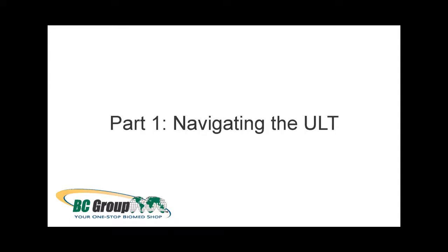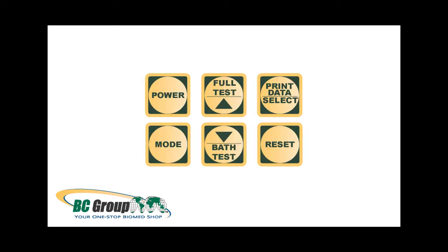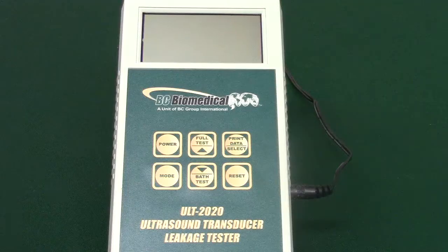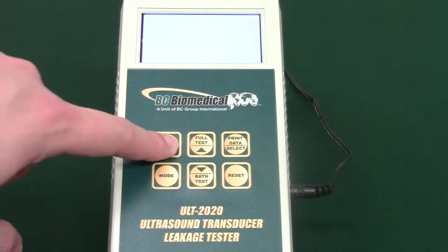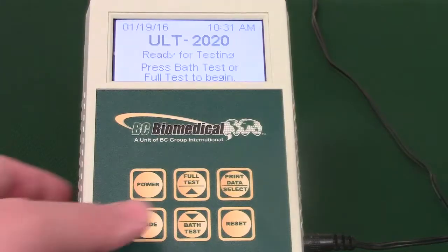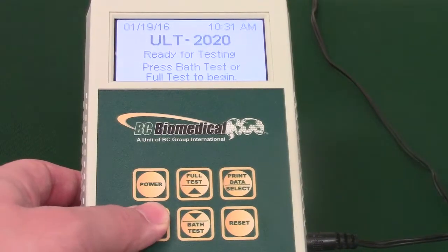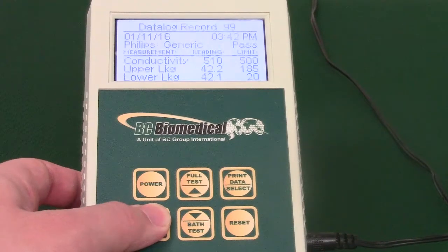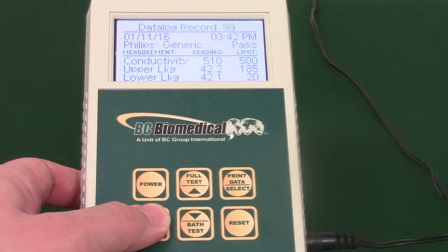Part 1: Navigating the ULT. When navigating the ULT, there are six main keys. The first is the power key, used for turning on your ULT. Next is the mode key. Use this to access the device configuration screen.